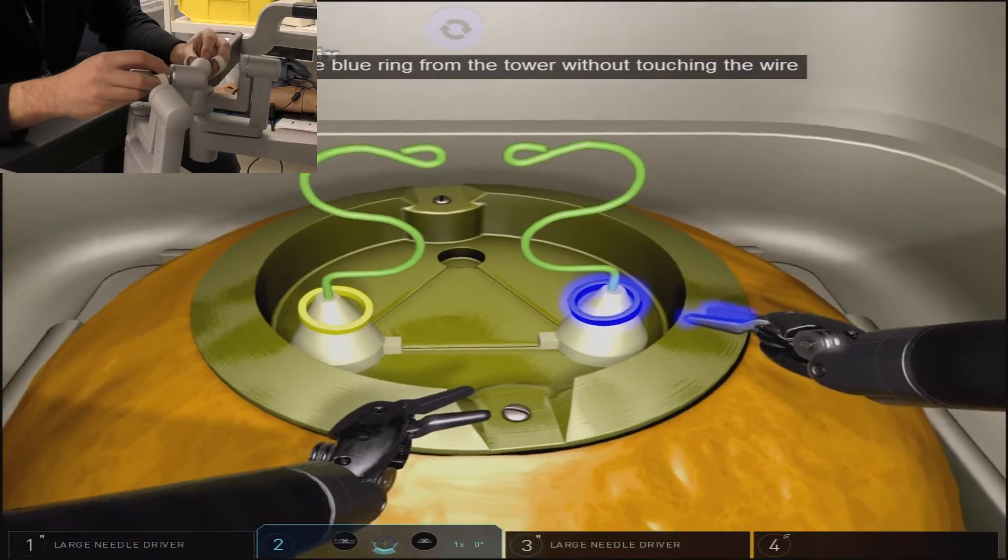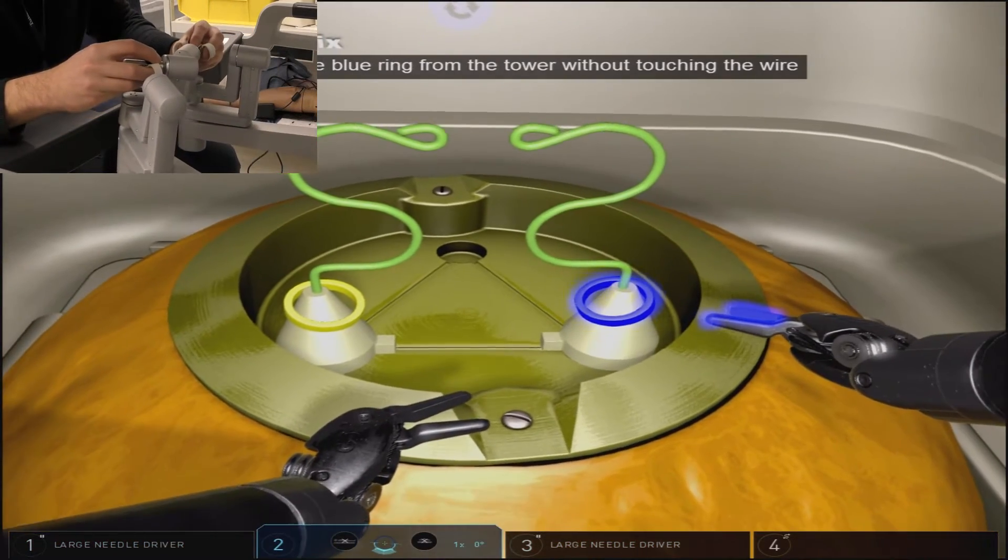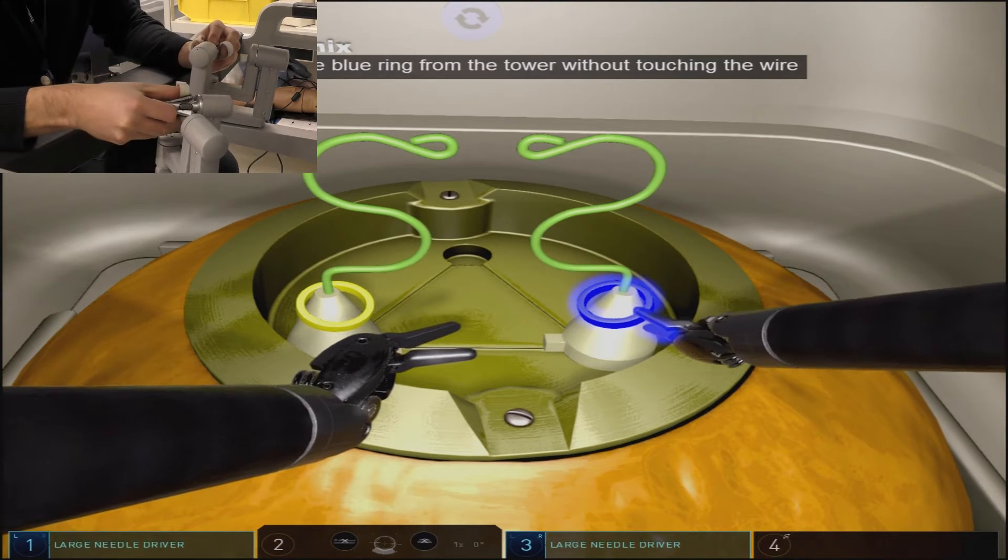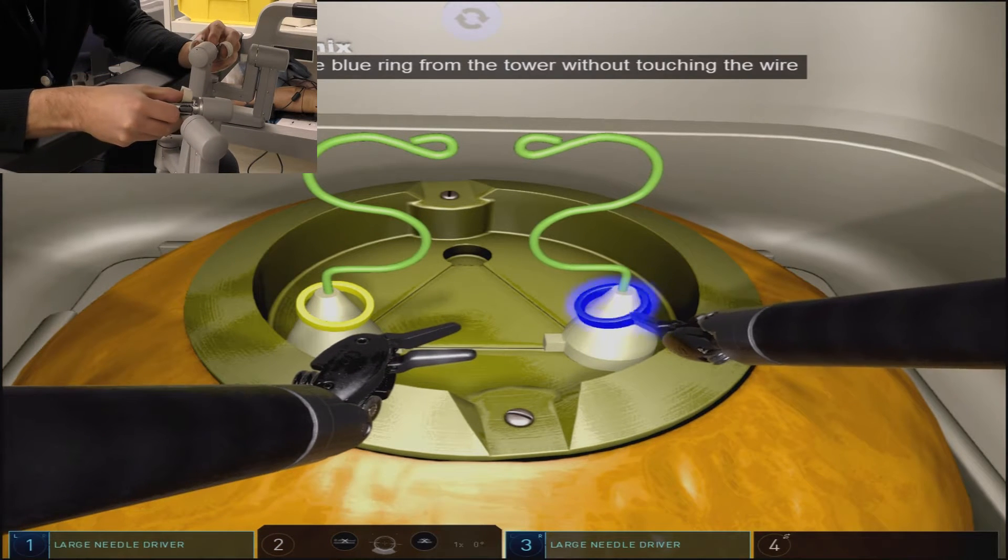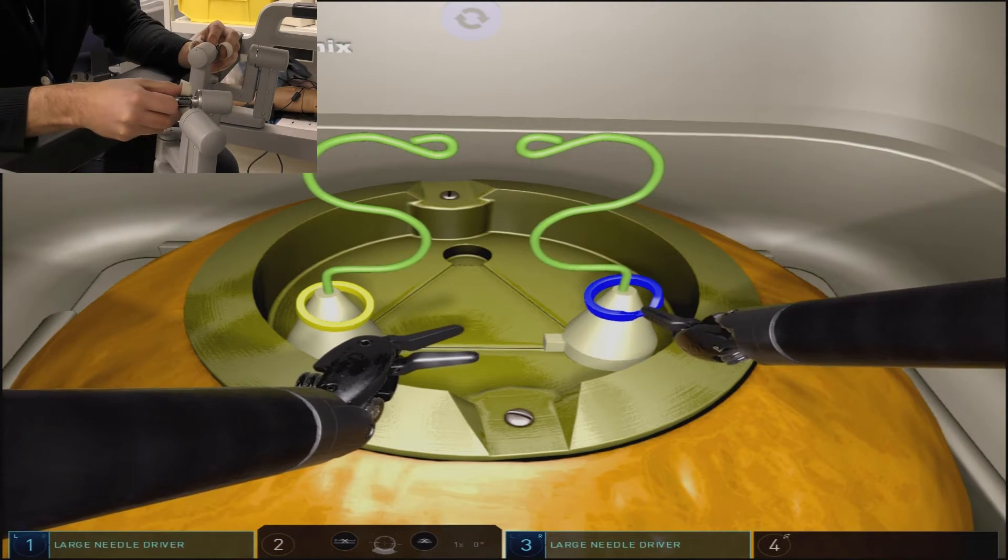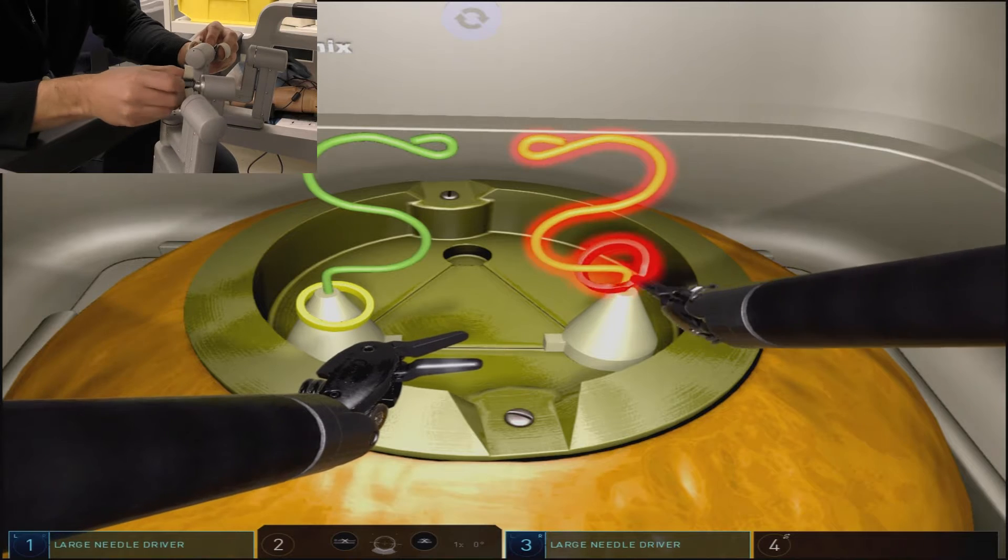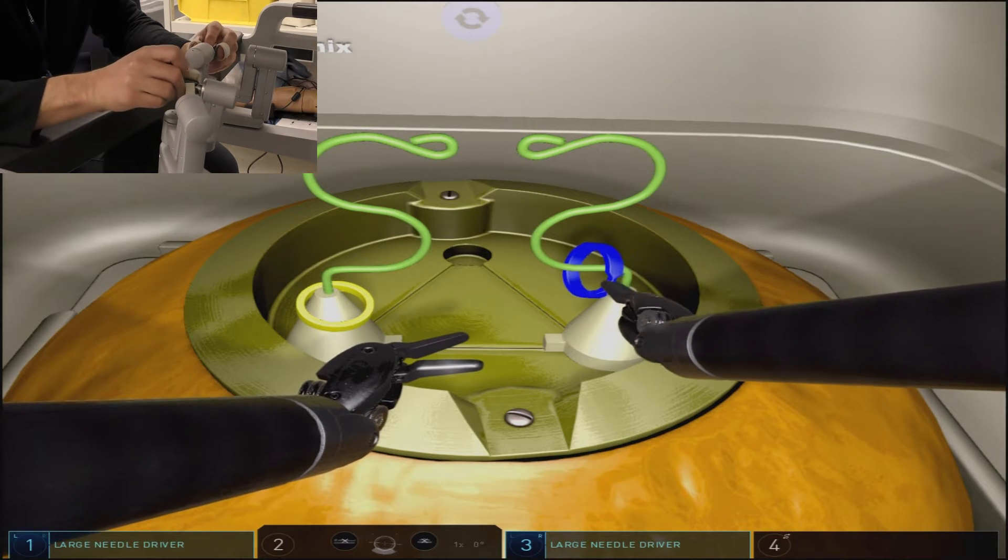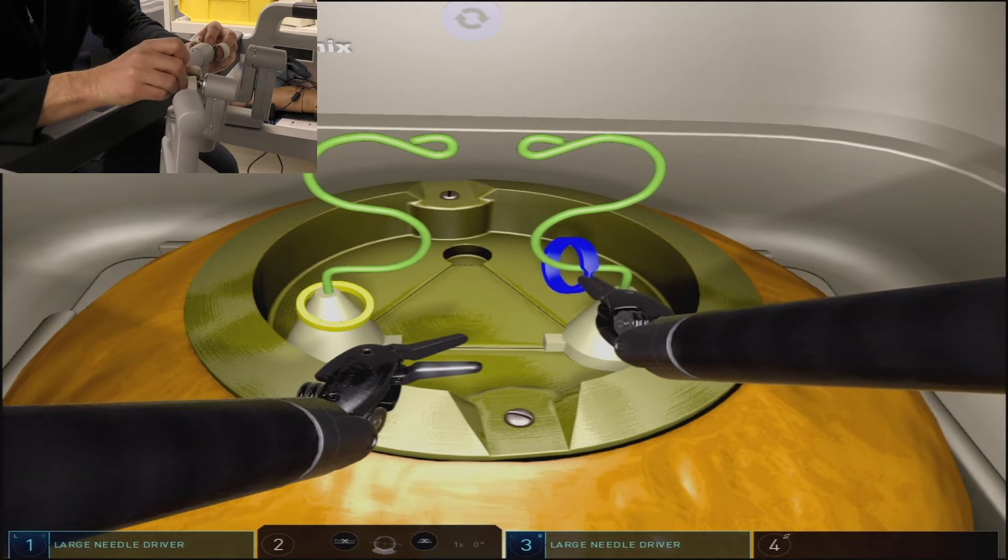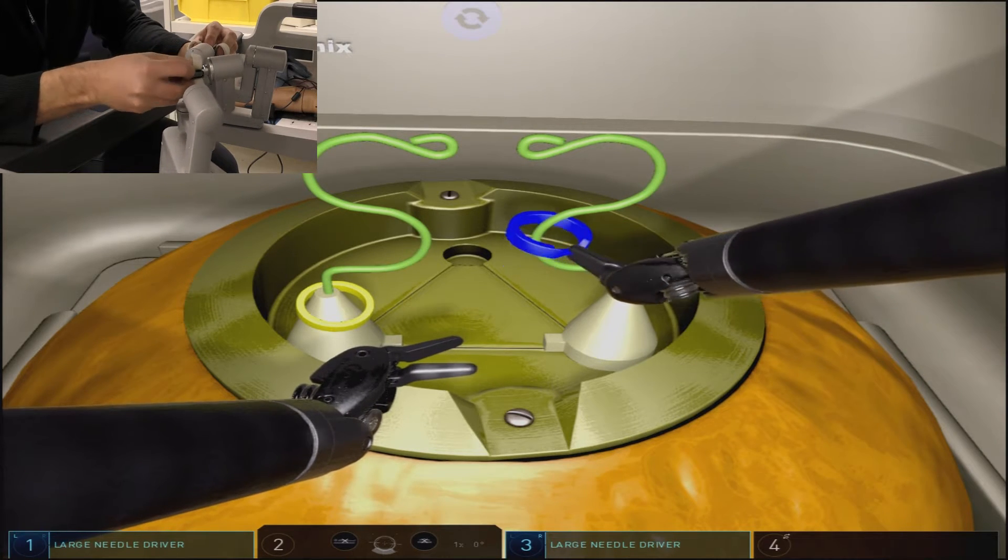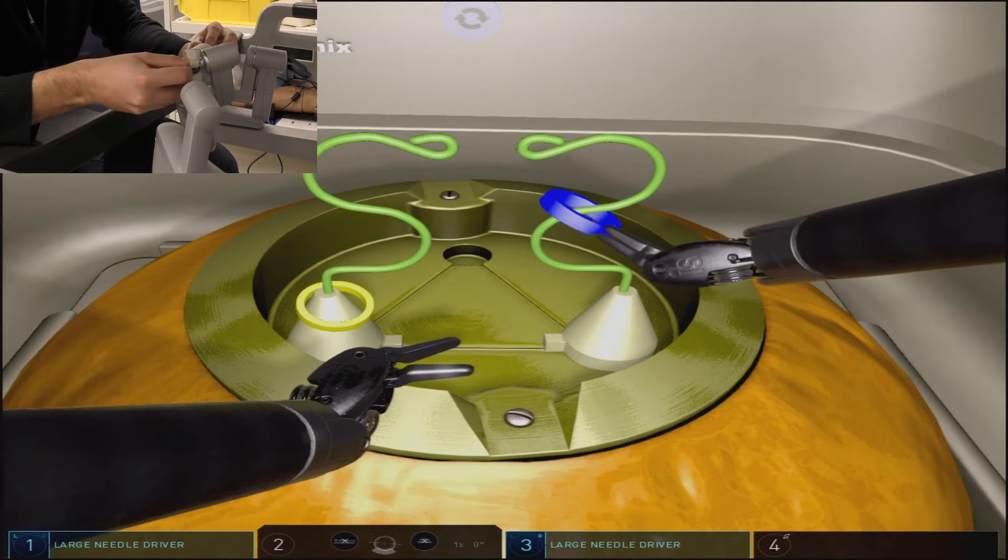The exercise begins with instructing you to grasp and pick up the blue ring on the right side of this ring tower. You then have to move the ring around the wire structure without causing any contact.